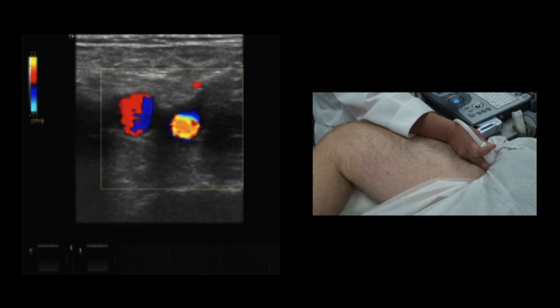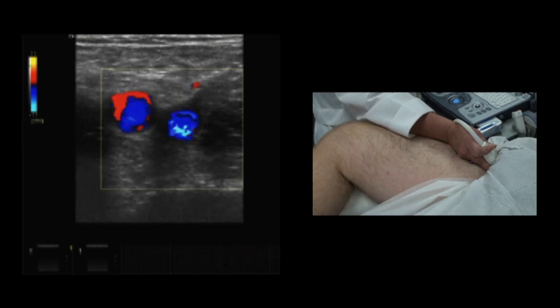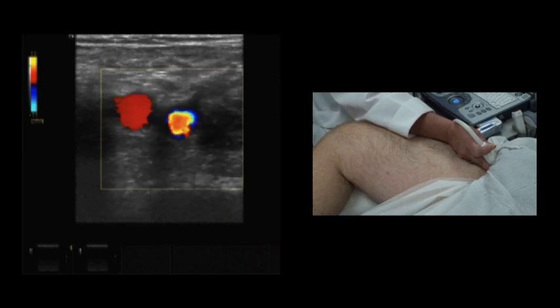If you pay close attention, you can see the artery is very pulsatile, and the venous system is very smooth and more continuous. And when you do see a decrease in that color, that's due to respiration. While the patient is inhaling, the color is decreasing. When he exhales, you can see the color filling back into the vessel.